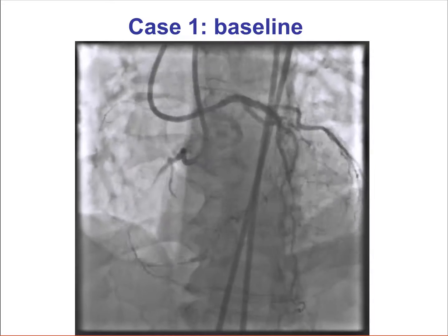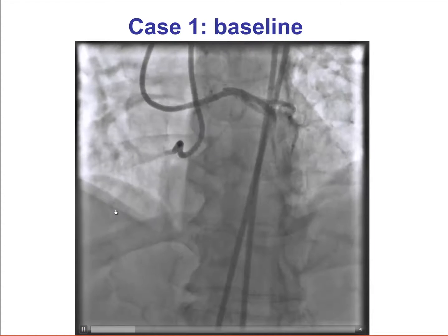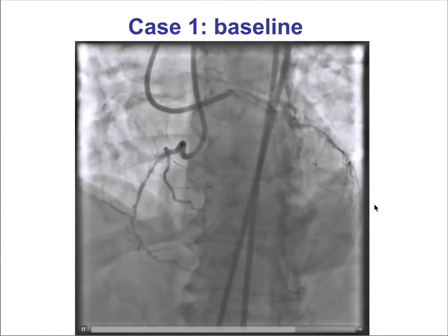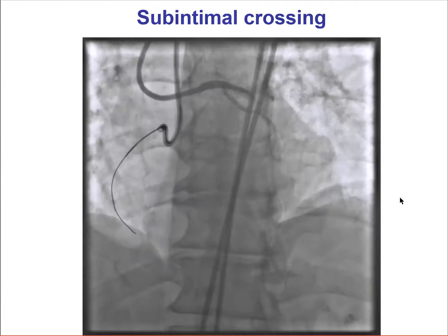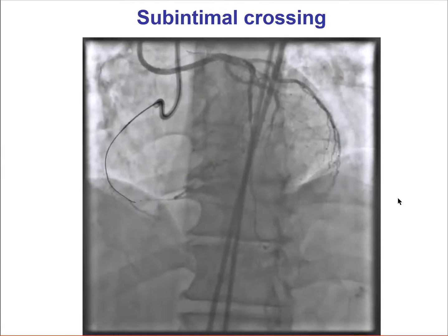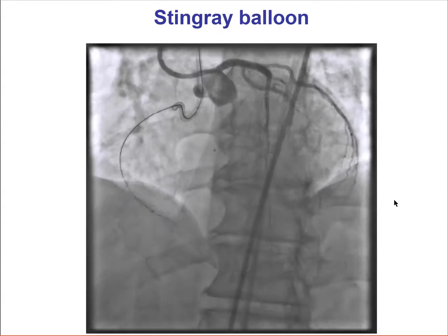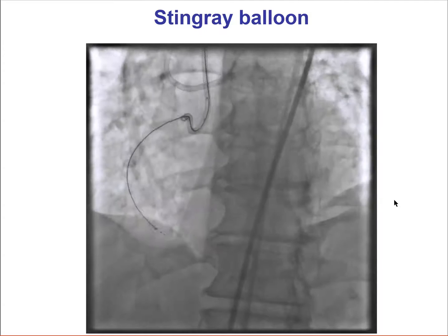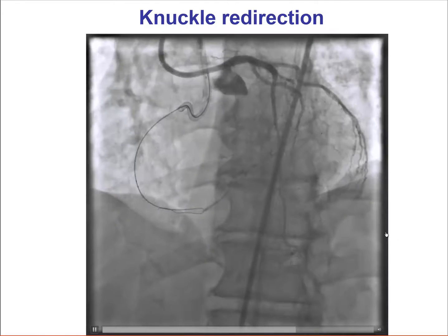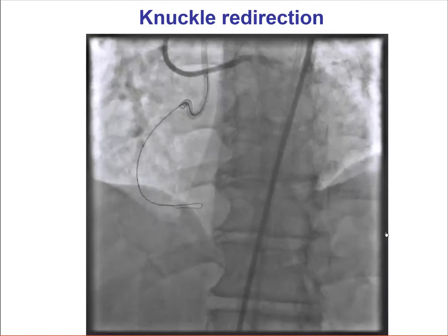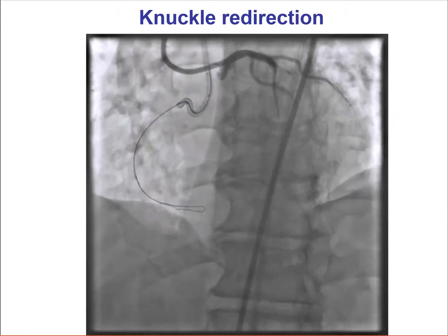This is the first case of a mid right coronary artery chronic total occlusion that has a large acute marginal branch proximal to the proximal cap and a diffusely diseased distal vessel. We attempted antegrade crossing using a Corsair catheter as well as a Fielder XT guidewire, which has entered into the subintimal space into the distal vessel. We advanced a Stingray balloon; however, the balloon entered into the acute marginal branch, so a Fielder XT wire was used to knuckle and bypass the acute marginal branch and deliver the Stingray balloon into the distal right coronary artery.